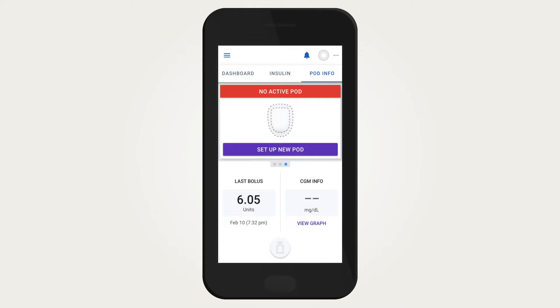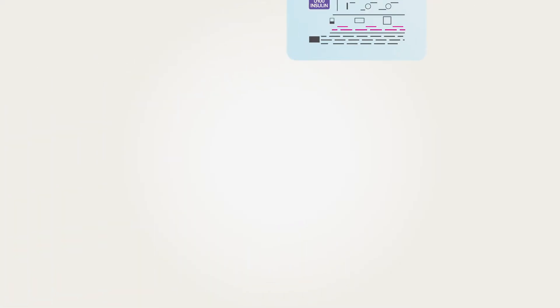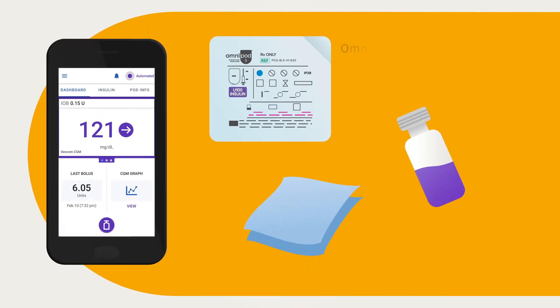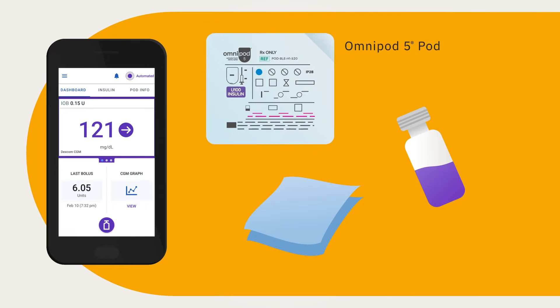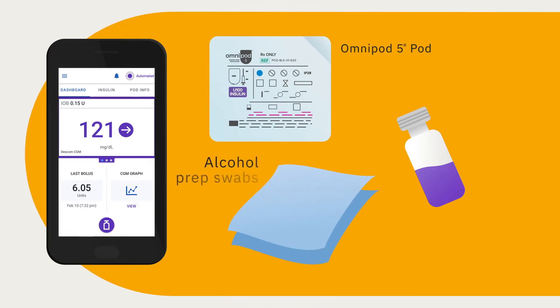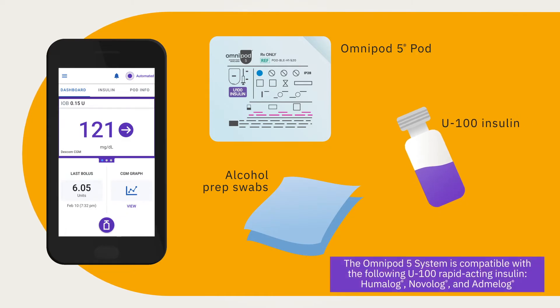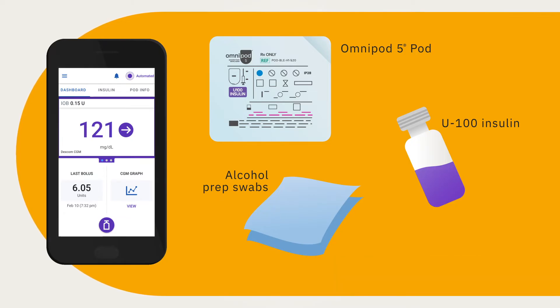Before activating a pod, gather the following items: your device running the Omnipod 5 app, an unopened Omnipod 5 pod, alcohol prep swabs, and a vial of room-temperature rapid-acting U100 insulin that has been cleared for use with the Omnipod 5 system. Never use a pod that has been damaged or dropped after removal from the package, as this may increase risk of infection.